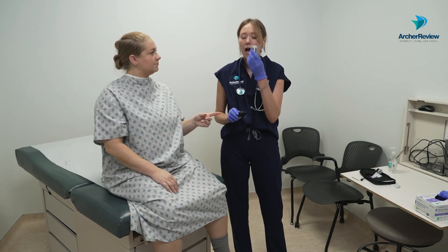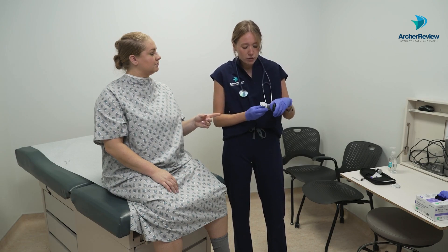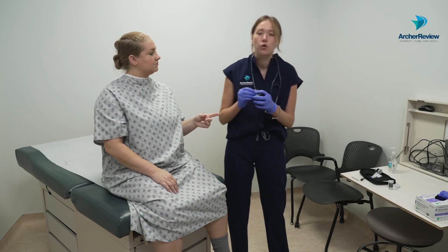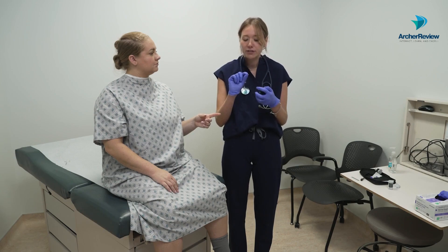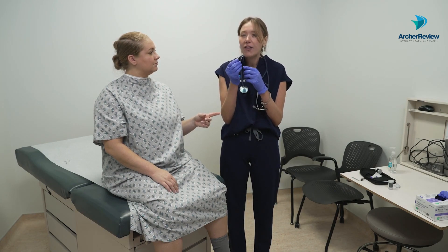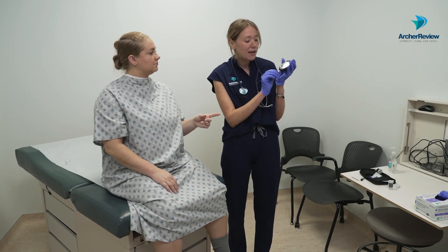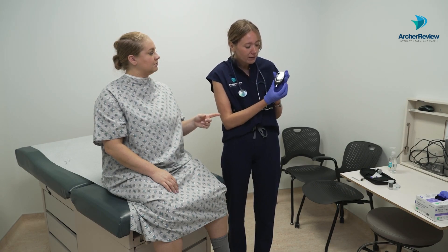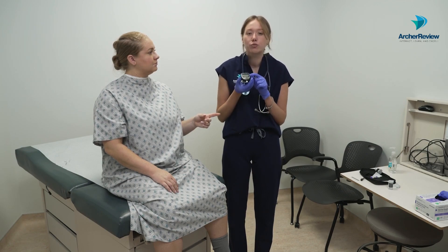Now grab your tub of glucometer strips and your glucometer. Remove one strip for this test. Every glucometer strip is going to look fairly similar — one end has a little line where the blood will go, while the other end has what looks like a computer chip. That computer chip inserts directly into the glucometer, which will turn on and beep with a little flashing drop of blood, letting us know it is ready for the blood.